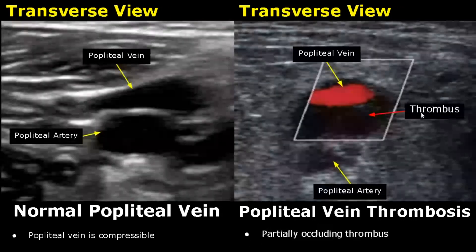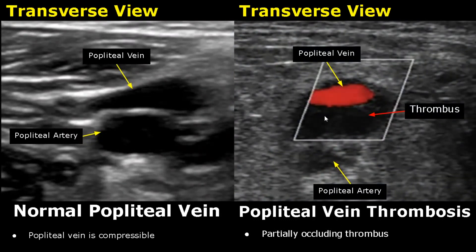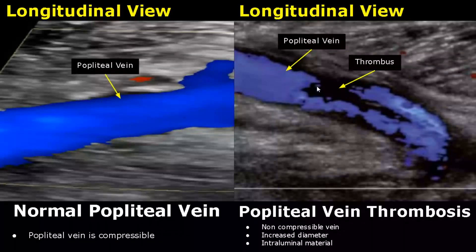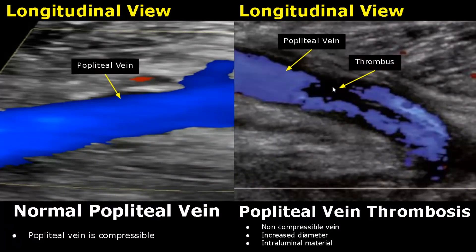In this image we can see partial occlusion of the vein due to thrombosis. Only this part of the vein has blood flow and no flow is seen over here. In this longitudinal view, we can see the partial occlusion more clearly.